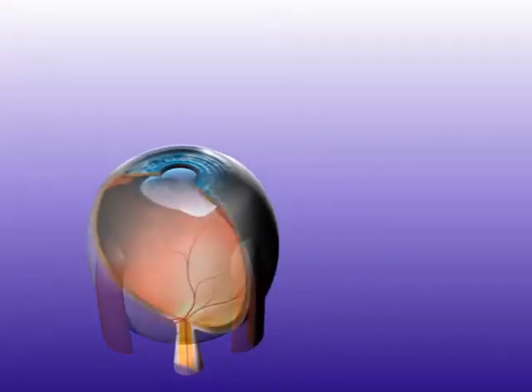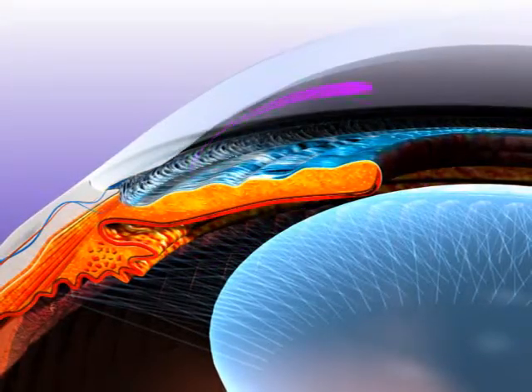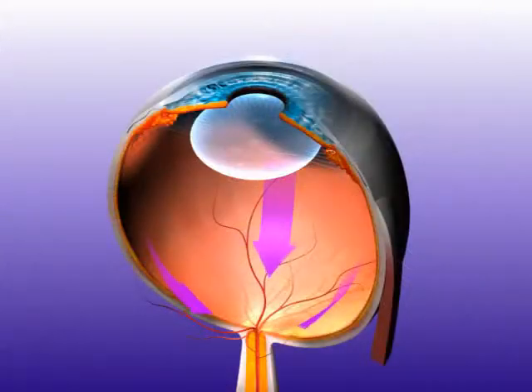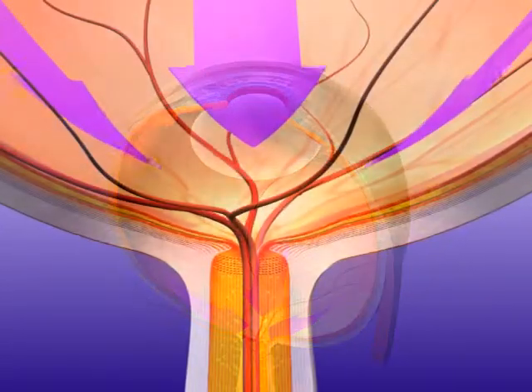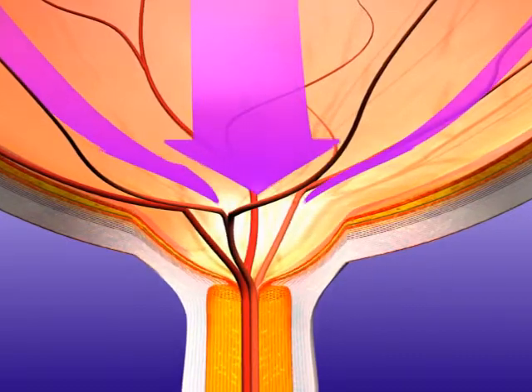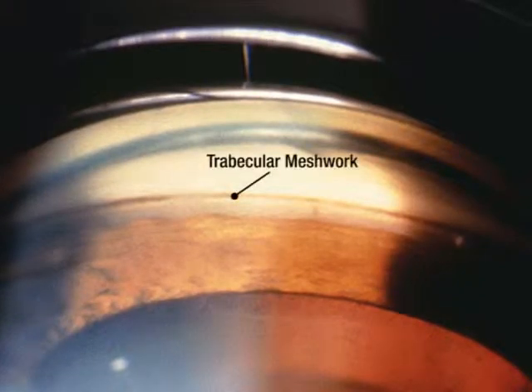Aqueous outflow and decreased outflow facility is recognized as the major pathology in open-angle glaucoma. Traditional filtering surgery bypasses the outflow pathway but results in problems related to hypotony and external filtration, such as infection and bleb dysesthesia.